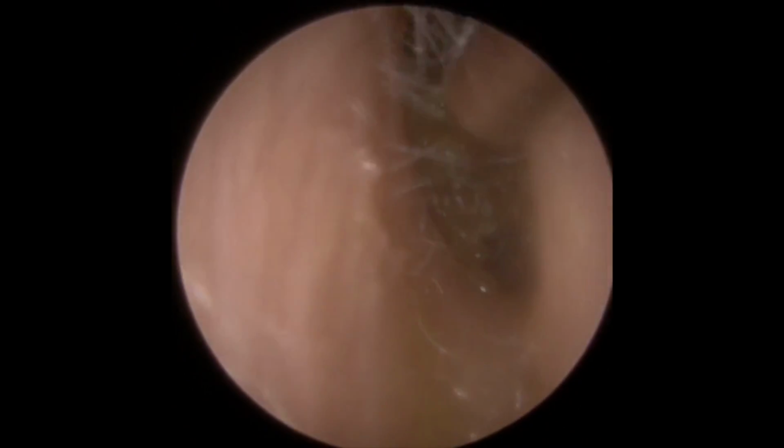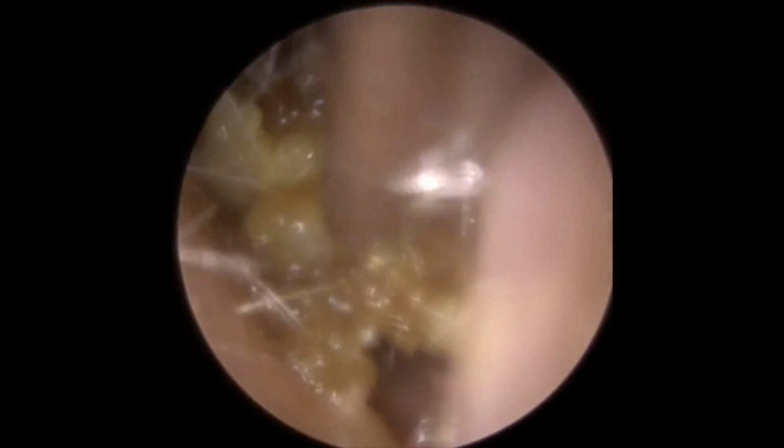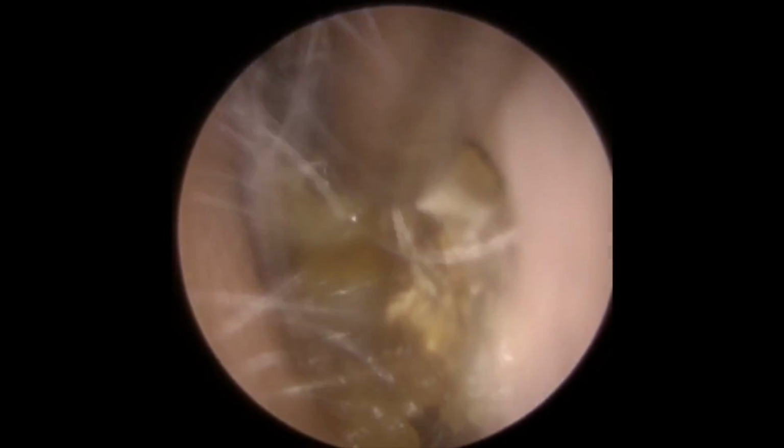Can you see we've got this softer section now at the top, so just working that down. There we are. This is actually a little bit of dry skin that's been embedded in the back of this wax, so I'm just trying to get a good enough grip on that to work this out. And as we start doing that, you can see in relation to the size of the piece, quite a big piece of that wax has come away. See a lot more of this skin debris getting sucked into the machine. Now we're starting to see this plug breaking down. It's starting to loosen up a little bit now.